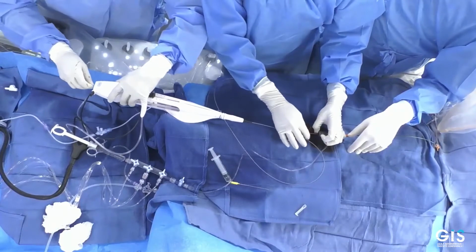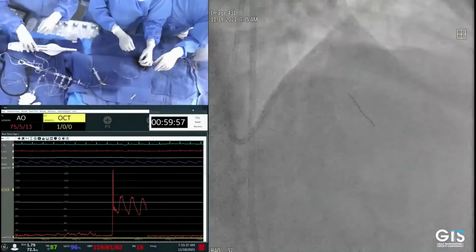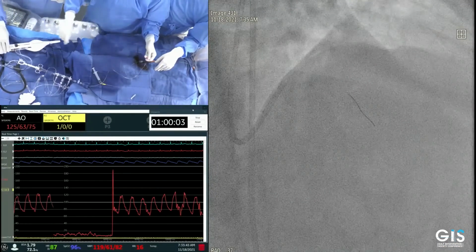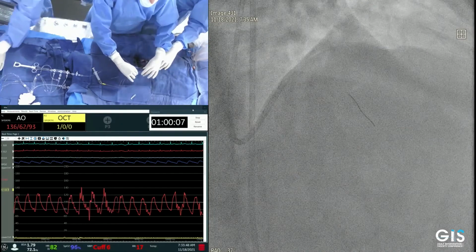So, Justin, will you do imaging again now before you do anything else? Well, yeah. You want to do another imaging run to confirm your results first, before crossing any balloon? Good. I need to ask a question for Dr. George. We'll do it after, I have a question for you.